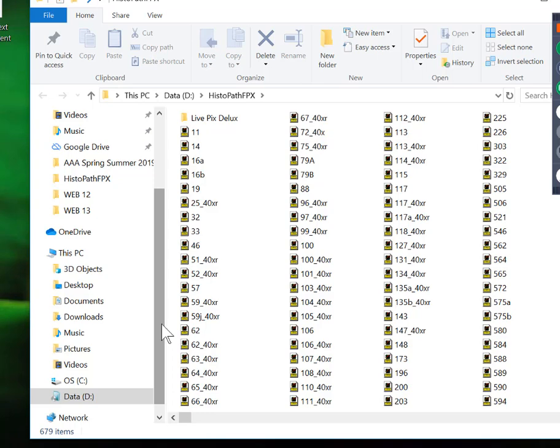We did it in either a smelly lab where there were formalin fumes all around, or a classroom in which there were 300 students. And it was hard to hear and it was hard to see. But now you get the benefit of the digital microscope, infinitely better than your old microscope, and amazing entertainment as well.